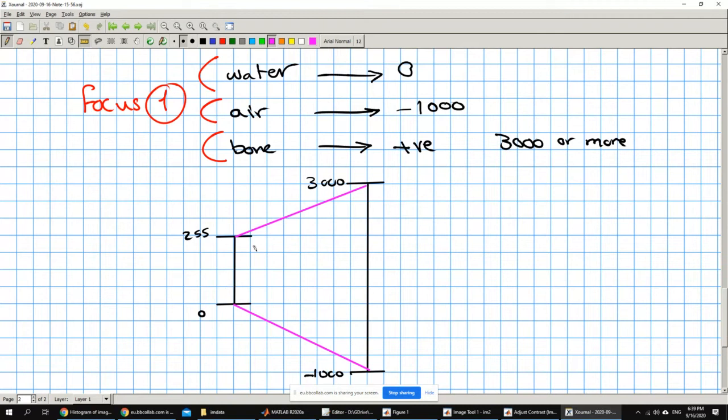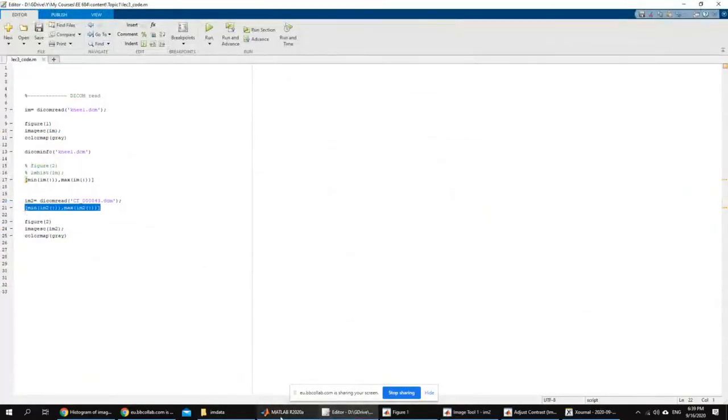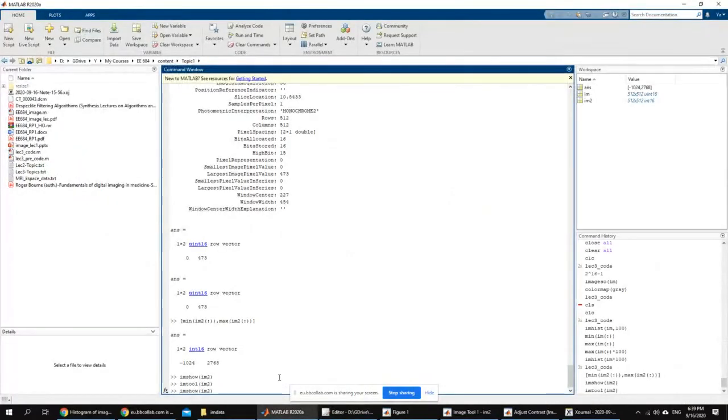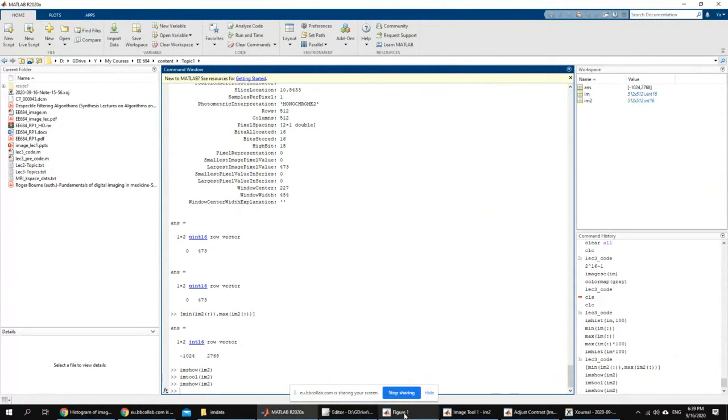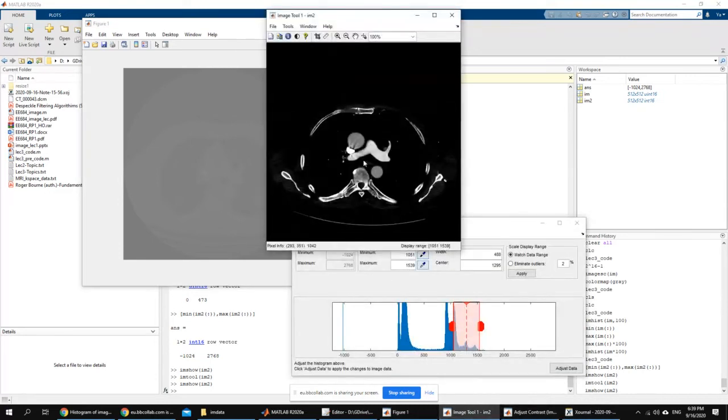If you do that, you're going to end up with an image that looks like the one that we just saw. Maybe I can just display it again. Image show. It looks like this, basically. Because most of the data, the numbers in the image, will be on the lower side, you can see something that doesn't have any contrast. The contrast is really very bad when you look at this image. We want to make it look like the image that we just saw here.